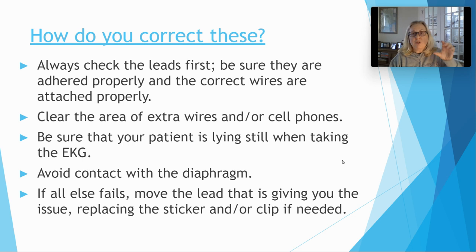Okay. The very last thing would be to replace the clip. So on your EKG machines with the little clippy things, they're plastic and they have like a little colored clip on them. They actually come off. So if that plastic thing is not clipping well, or the plastic thing breaks off and the clip doesn't work at all, you can literally just pull that piece off, and there's extra ones in the little buckets underneath the EKG carts. Okay, in that little bucket, there's everything you need.